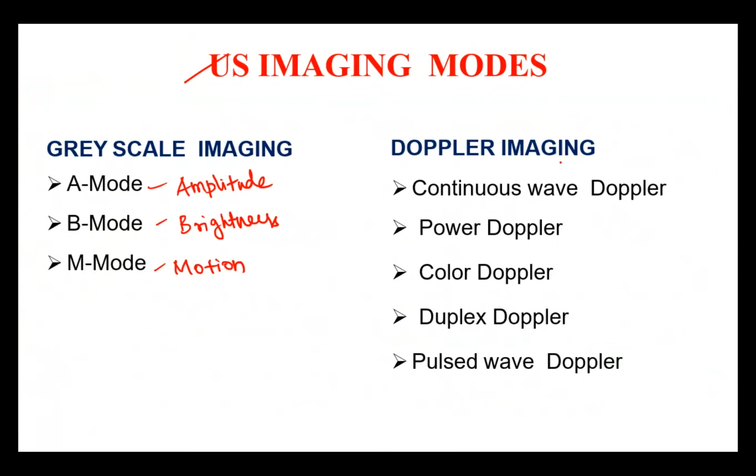Yes. So apart from that, we have Doppler imaging. Doppler imaging in the sense we can do color imaging. So color ultrasound imaging is possible nowadays. Every day there are a lot of improvements going on in ultrasound. Five years back we didn't have color Doppler, duplex Doppler and all.